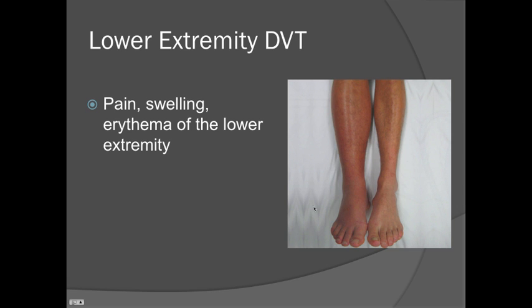And as you can see in this picture here, the patient's right leg is markedly more swollen than the left, and it's kind of developed this sheen. You can see here the reflection from the light as the leg has become more swollen and the skin becomes more stretched along with it, and we can also see the redness that's developed in this patient's leg here.